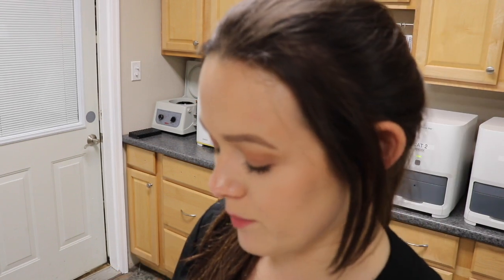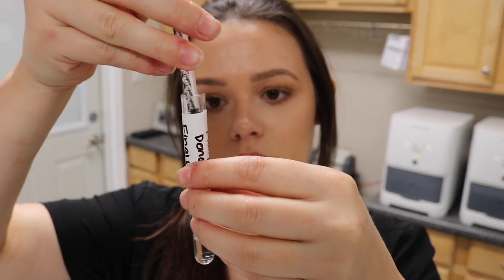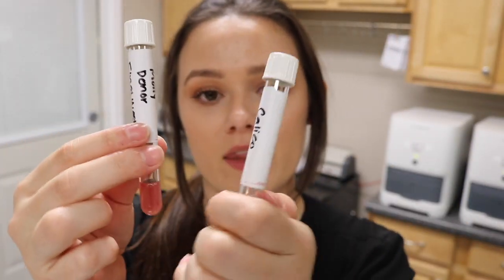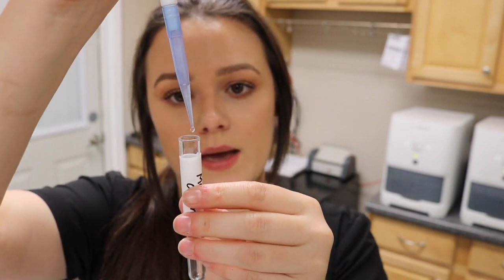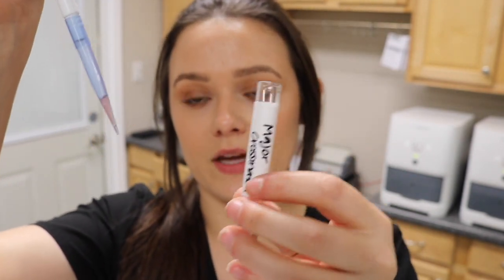This is what the final cell suspension looks like for both the donor and the recipient. To perform the major cross-match, I'm going to take two drops of the recipient's serum and two drops of the donor's cell suspension into a new tube labeled 'major cross-match.' I'll add two drops of the recipient's serum, then two drops of the donor cell suspension, mix gently, and set it aside.